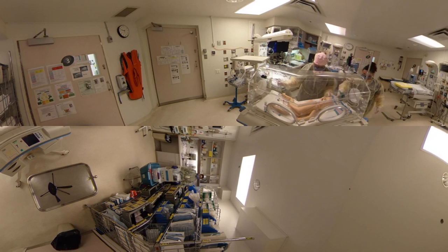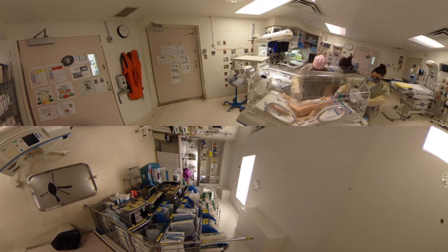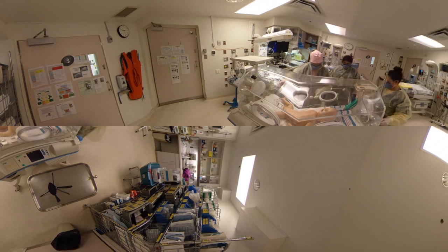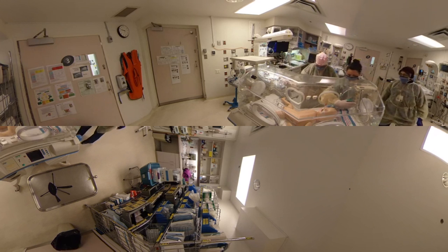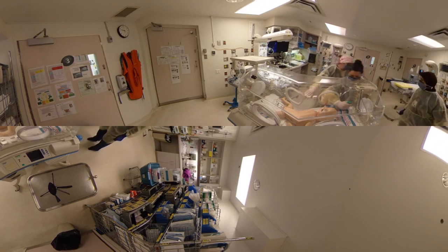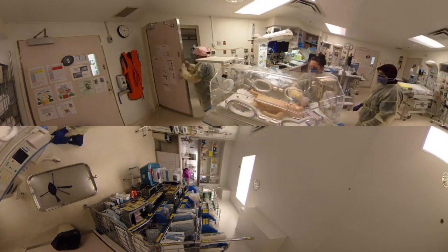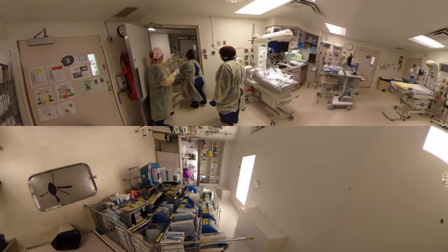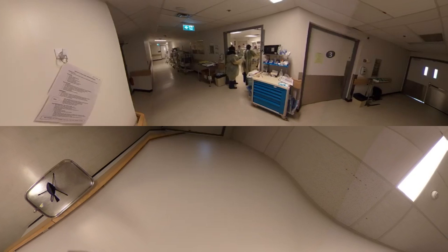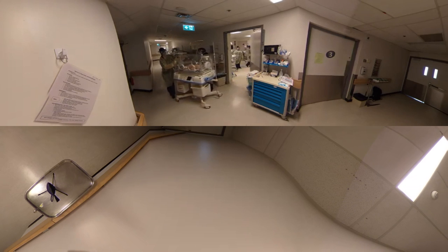Let's do this. We're just going to put the oxygen tank here and then take it with us. We've got our little monitor. You're going to pull the oxygen tank. There you go — keep dragging. Stop.